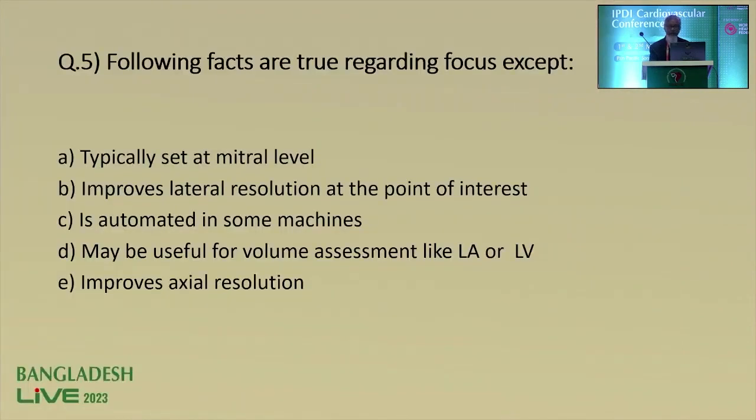So our next question was on focus. Focus is important because it increases the lateral resolution. So, new term: lateral resolution. If we can distinguish between two points which lie lateral to each other, they can be well visualized with focus.